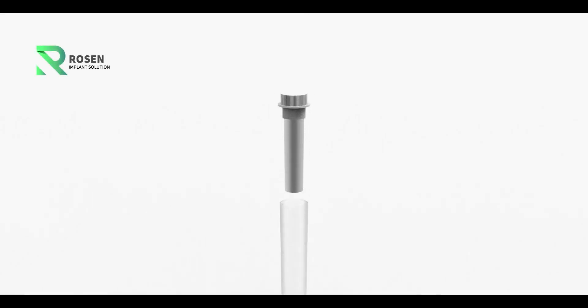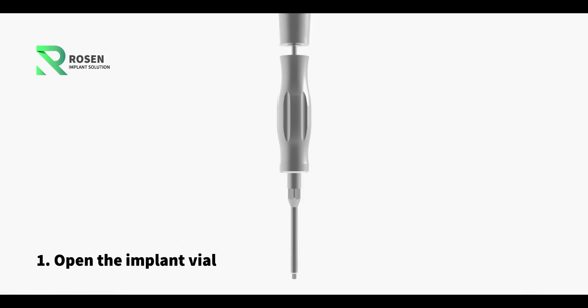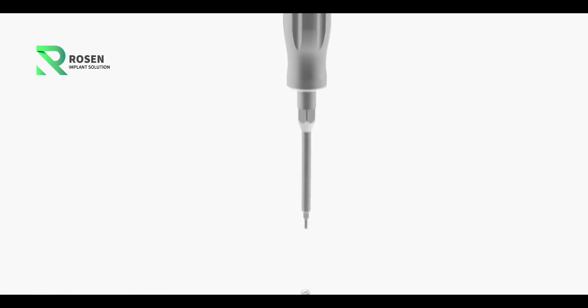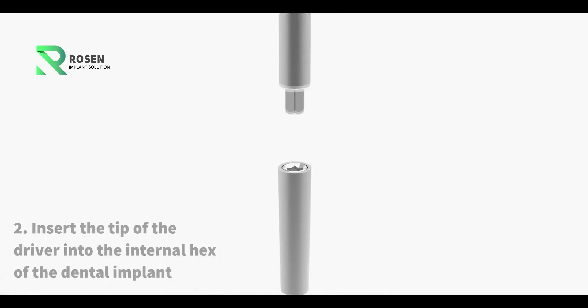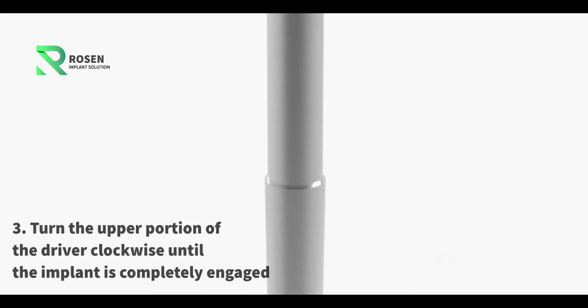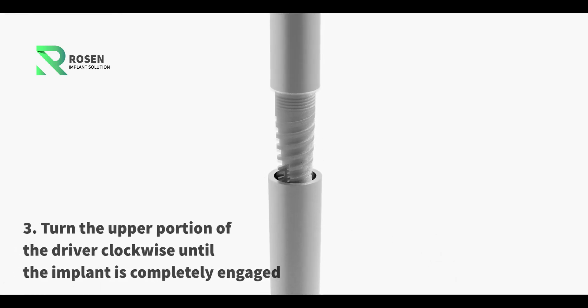User manual. Step 1: Open the implant vial. Step 2: Insert the tip of the driver into the internal hex of the dental implant. Step 3: Turn the upper portion of the driver clockwise until the implant is completely engaged.